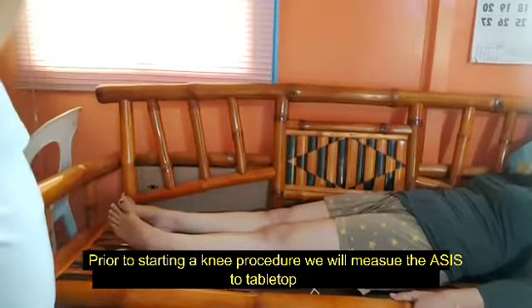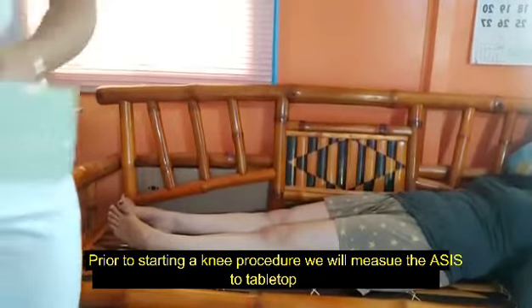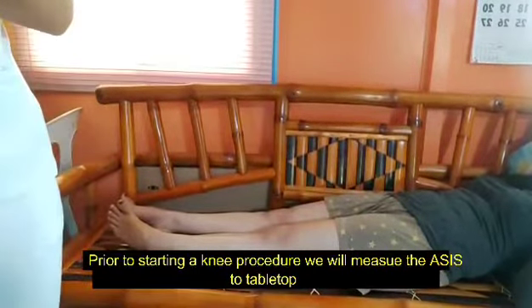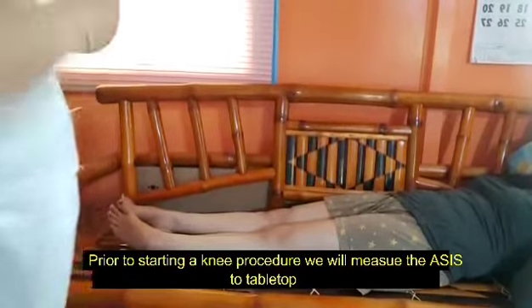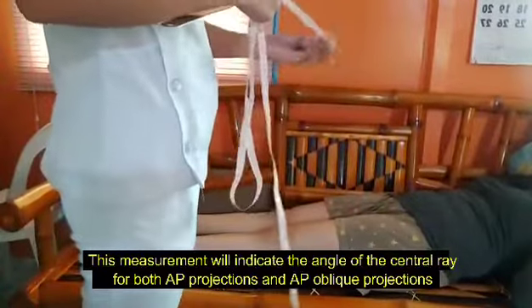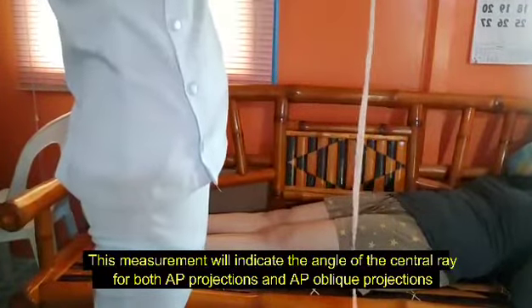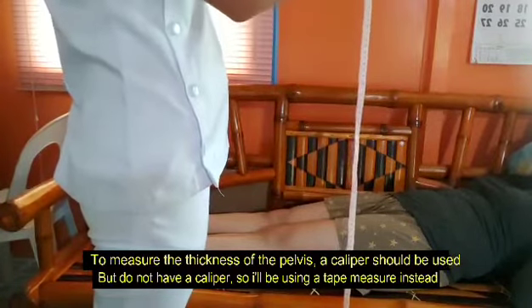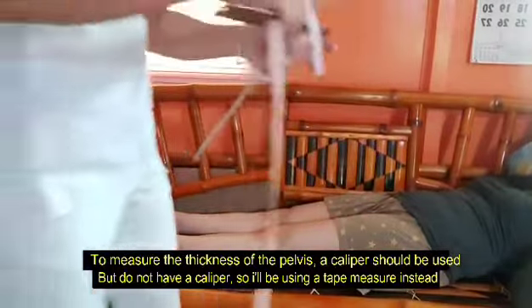Prior to starting a knee procedure, we will measure the ASIS, or the anterior superior iliac spine, to tabletop. This measurement will indicate the angle of the central ray for both AP projections and AP oblique projections. To measure the thickness of the pelvis, a caliper should be used.